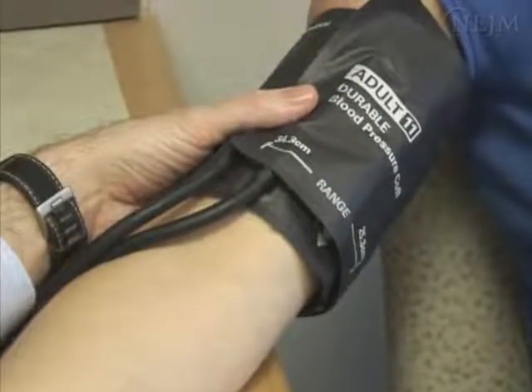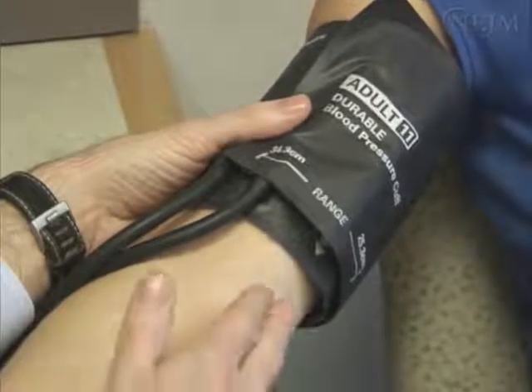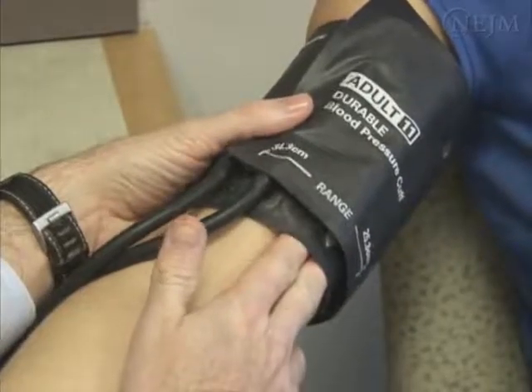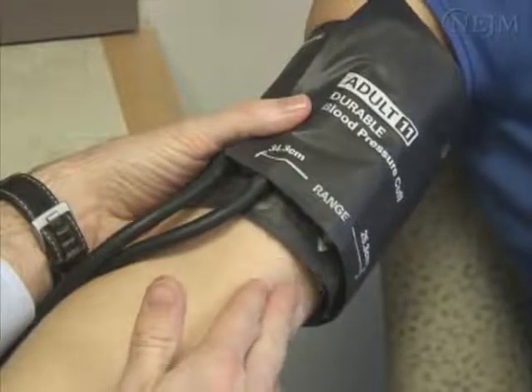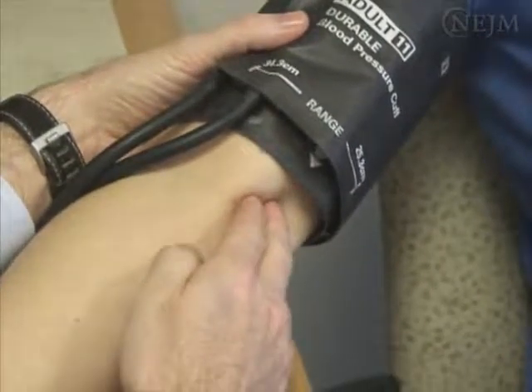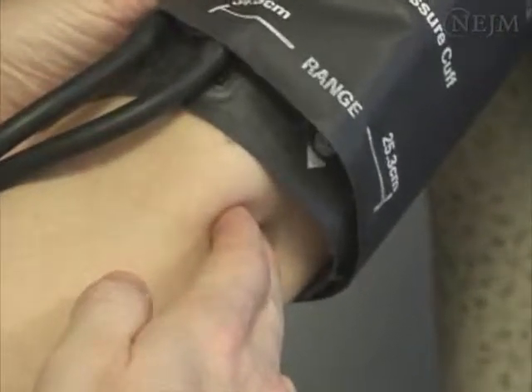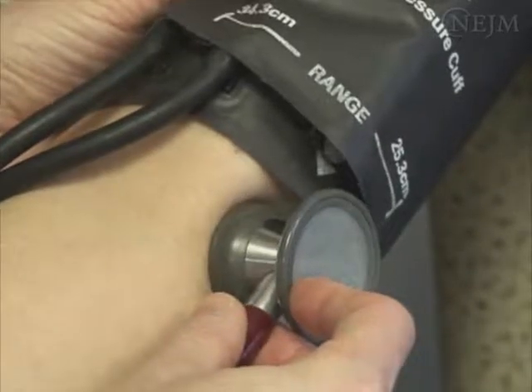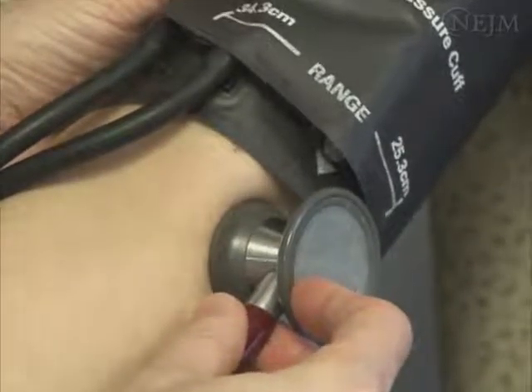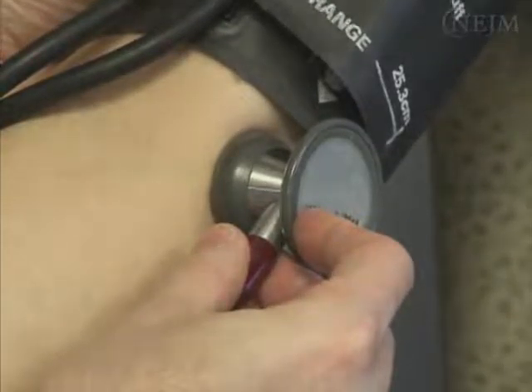The cuff should be applied two centimeters above the crease of the elbow. It should fit snugly, but still allow two finger widths under the cuff. Next, find the brachial artery, which is palpable approximately four to five centimeters from the medial epicondyle on the anterior surface of the elbow. Place the stethoscope lightly against the skin over the brachial artery. There should be appropriate pressure to ensure good sound transmission. The stethoscope should not be in contact with clothing or with the cuff.